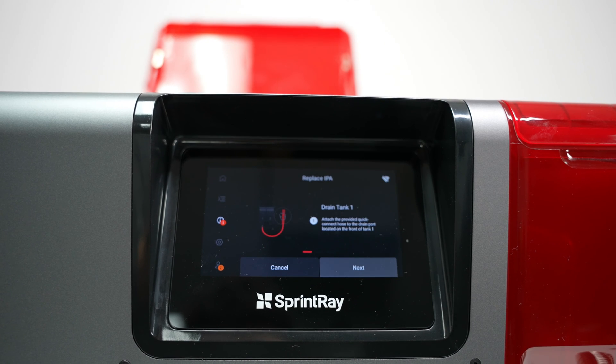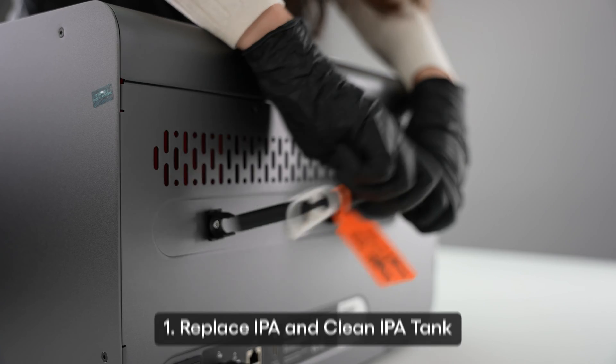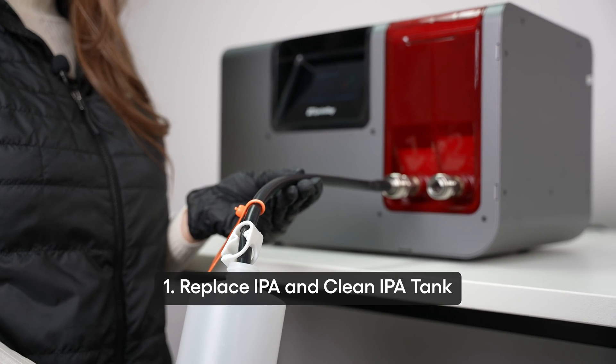When the screen prompts you or a hydrometer floats, replace the IPA and clean the tank right away.